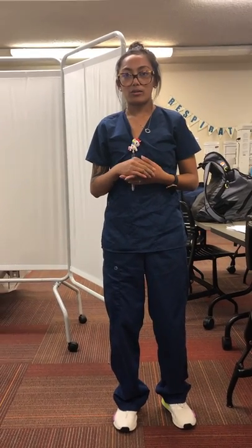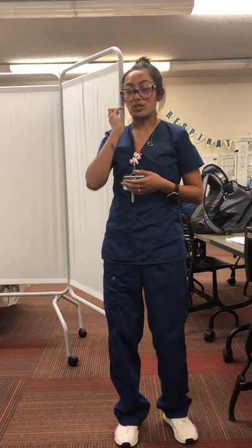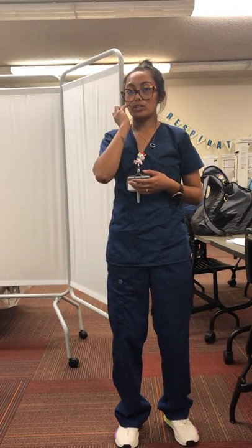Hi, my name is Bernie, and I'm going to be doing my SVN competency. So today, prior to entering into the patient's room, I will be checking the patient's past medical history record. This is to help me find any information that will help me with my encounter with the patient today.